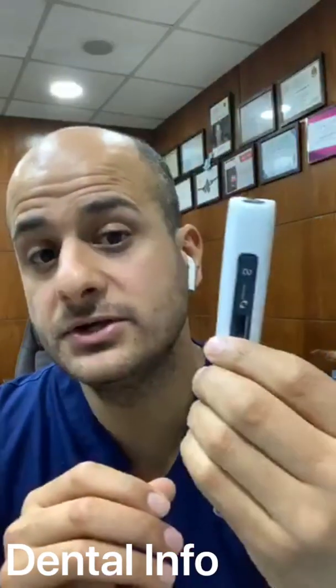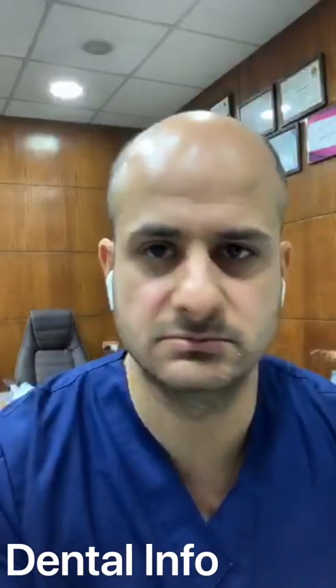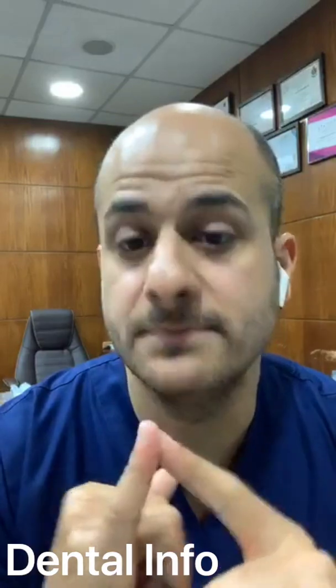There is danger of irritating the periodontium due to the temperature used when cutting the gutta percha. Okay, of course, there's a very big danger here. I told you that Fast Pack has a very good feature that gives you just 5 seconds to make the mission. If you want to reheat again, you have to take another 5 seconds. Because some devices have no limit. You can press for 5 minutes and you will burn the patient and you will burn the bone, and nobody will notice that. So timing here is very important, and training here is very important, not to exceed the time.